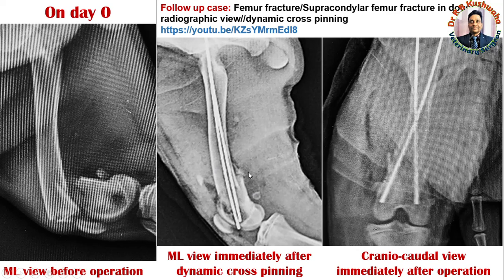This is the mediolateral view of this cross-pinning. In the mediolateral view it is very difficult to say from where the pins cross, but one pin is inserted from the lateral epicondyle and another one is inserted from the medial epicondyle. This is the craniocaudal view of this fractured bone — the craniocaudal view of the supracondylar fracture immediately after repair with cross-pinning.